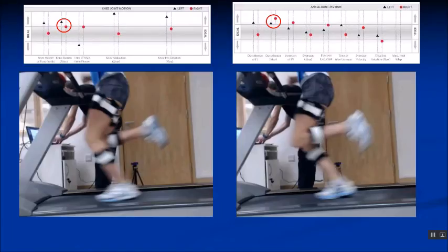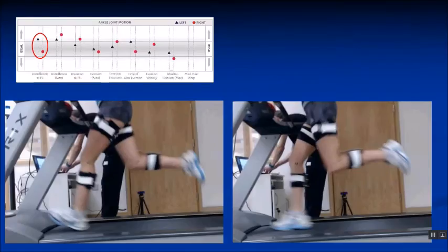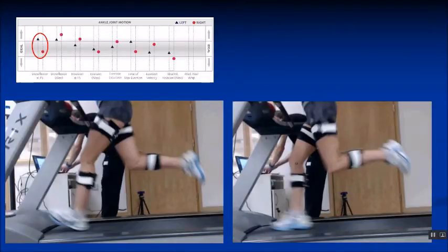In the sagittal plane we can see that there's excessive knee flexion and ankle dorsiflexion, and as a result there is reduced vertical excursion as a lot of the motion is happening around the knee and the ankle. Looking at the foot and ankle, for the left-sided heel strike we have increased dorsiflexion, and for the forefoot strike it's within the normal range but less than the left side.